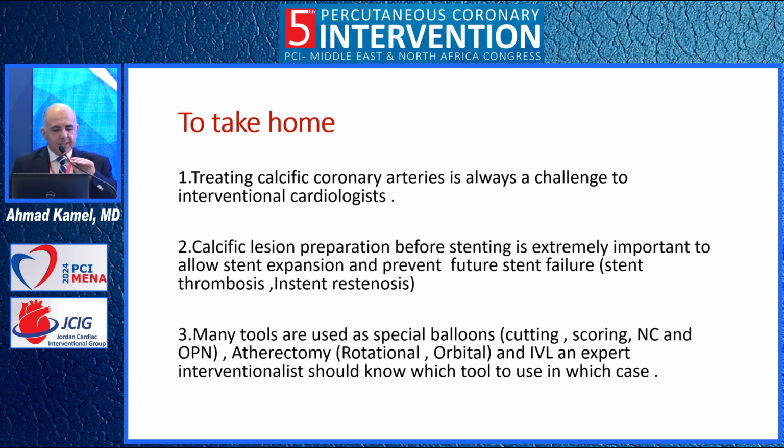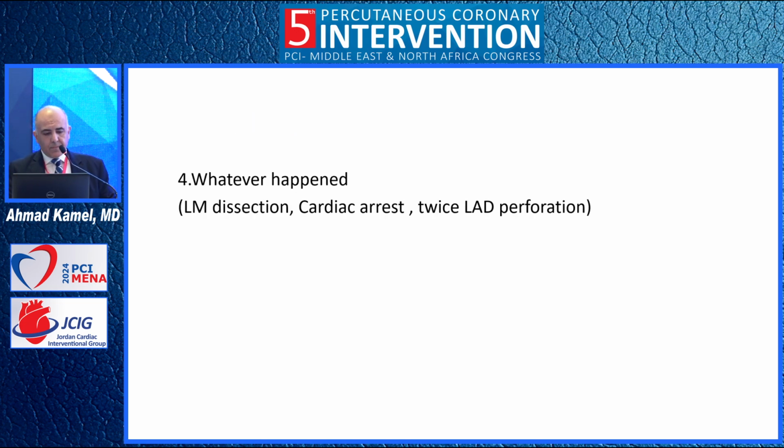So my take-home message is treating calcified coronary arteries is always a challenge to interventional cardiologists. Calcific lesion preparation before stenting is extremely important to allow stent expansion and prevent future stent failure, which is stent thrombosis and in-stent restenosis. So we have many tools, and Dr. Fadi Qaisi said we have many tools that can be used to treat or predilate calcific lesions: cutting and scoring balloons, non-compliant OPN balloons, atherectomy, whether rotational or orbital, IVL. An expert interventional cardiologist should know which tool to use in which case.